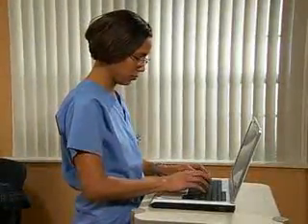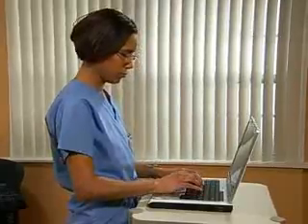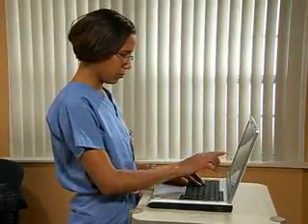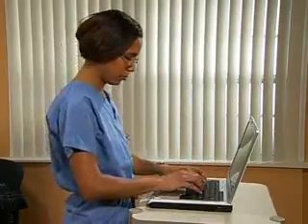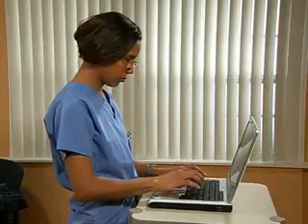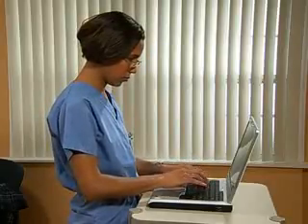Before administering a subcutaneous injection, review the medication administration record, or MAR. Also, observe the first 5 rights of medication administration, and later address the 6th right, documentation, as shown in the video skill, ensuring the 6 rights of medication administration.